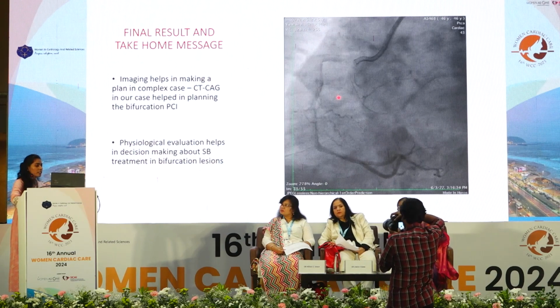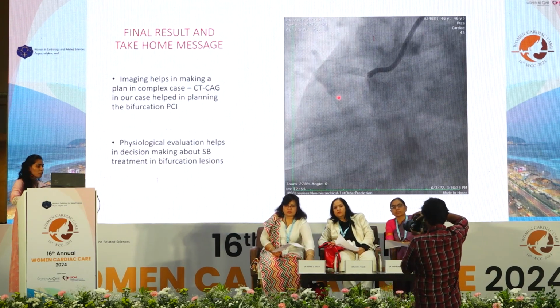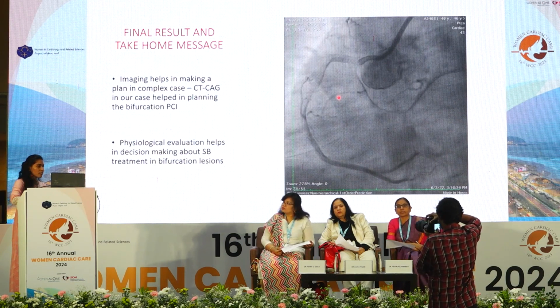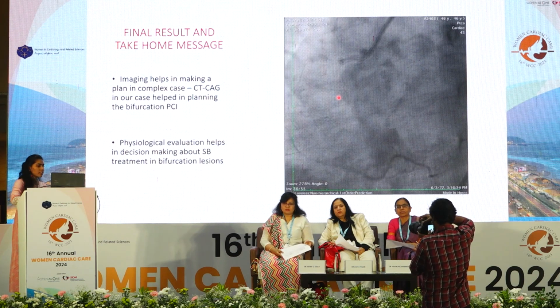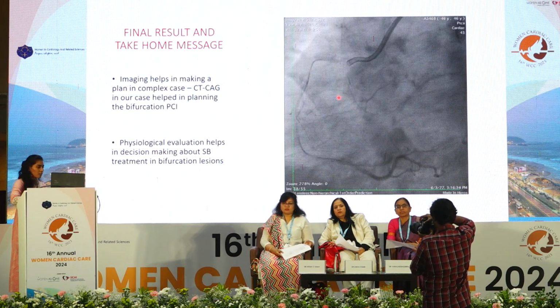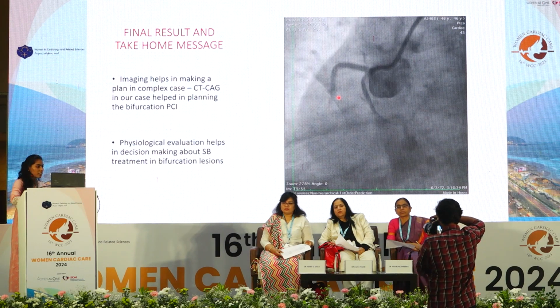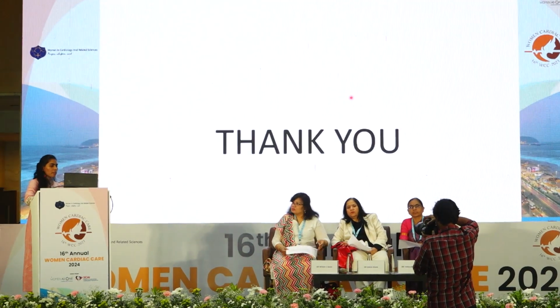Here is the final result: the stent is well expanded, with TIMI-3 flow in LCX. Our take-home message is that imaging helps in making a plan in complex cases. In our case, CT-CAG helped in planning the bifurcation stenting, and physiological evaluation helps in decision making about side branch treatment in bifurcation lesions. Thank you.